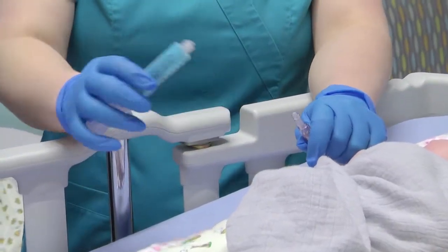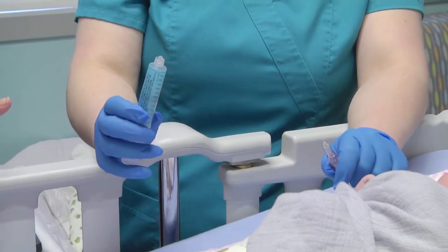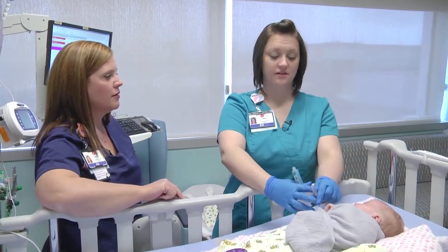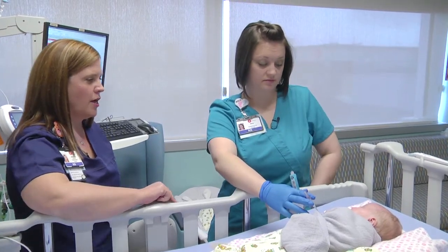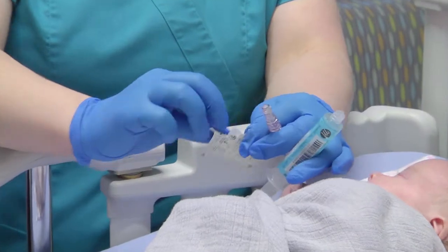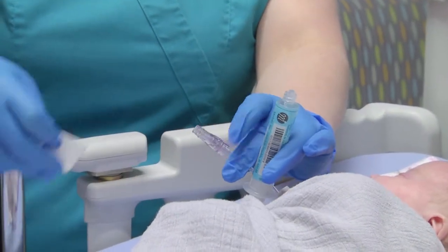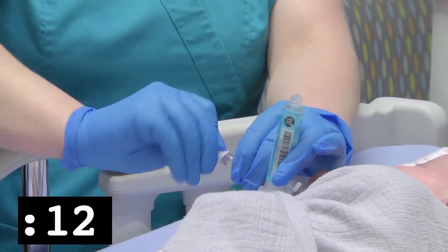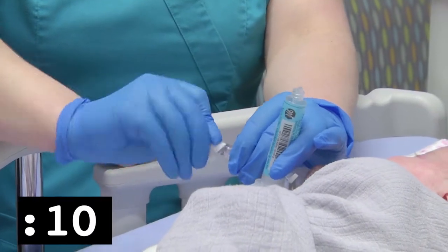Oh, Misty, we're going to need to stop. There's no blue cap on that clave, so we're going to need to clean it. Oh, yeah, I forgot. I have my alcohol right here. Great. And how long are you going to clean it for? I'm going to scrub for 15 seconds and let it dry for 15 seconds. And we're scrubbing because alcohol needs friction in order to activate.